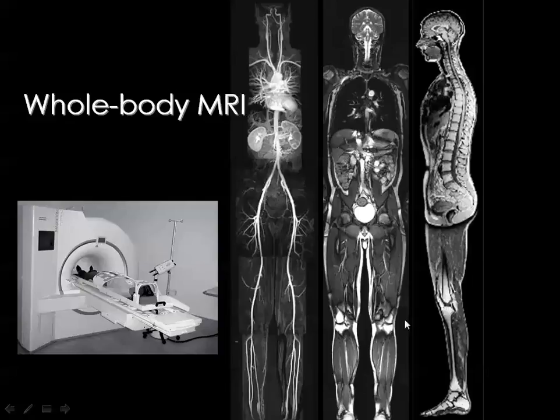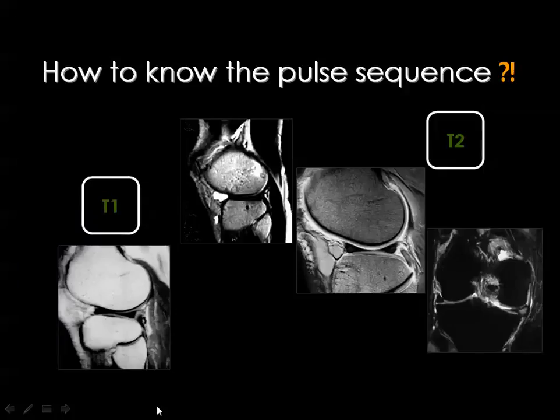This is preferred by many of the investigators, comparing whole body MRI to the bone scan. They said that bone scan can only show the bone lesions, but the whole body MRI can also show the spinal cord. It can give an idea about the brain and some ideas about the liver, if there are focal lesions in the liver, and it can also show the muscles. It can show the femoral shaft as well as most of the bones, and you can also have an idea about the vascularity of the lesion.